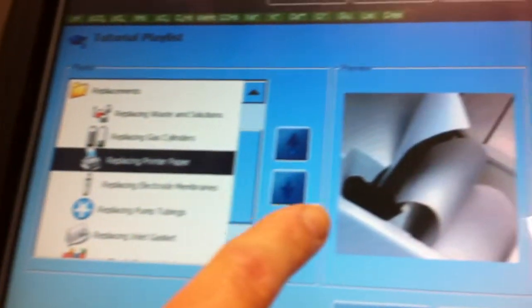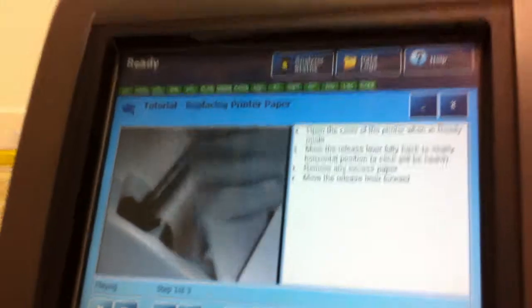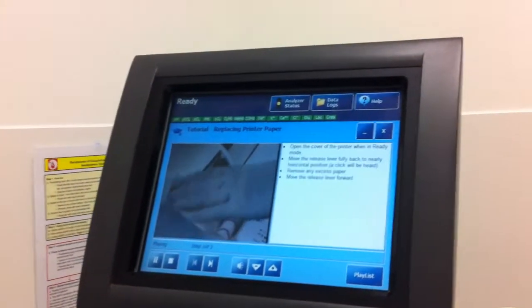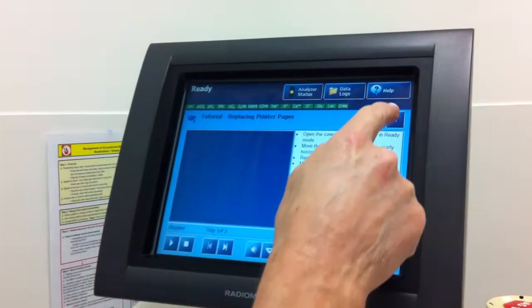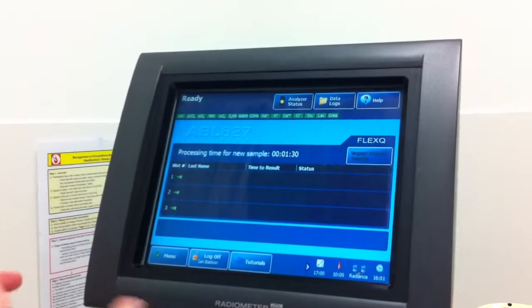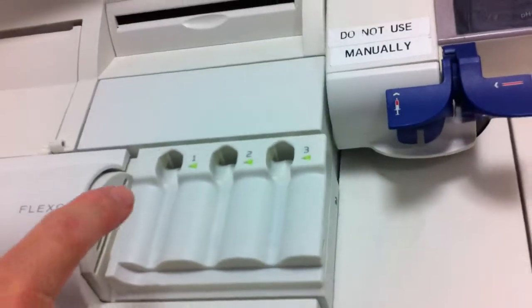If I press that one, a video comes up and it shows you over here. If I press play, you'll now see the video runs right in front of us. I'll turn it off and we can close that window. You can see there's one on how to change the printer paper. Just the last thing to finish on for this little video is to see what's called the FlexQ tray here.